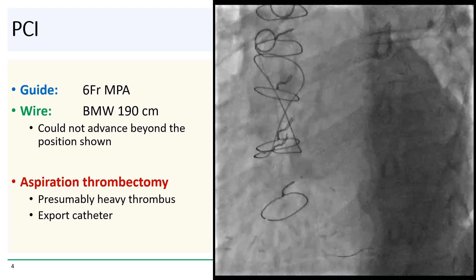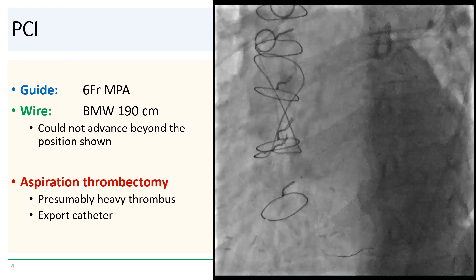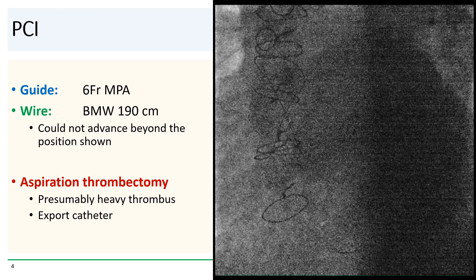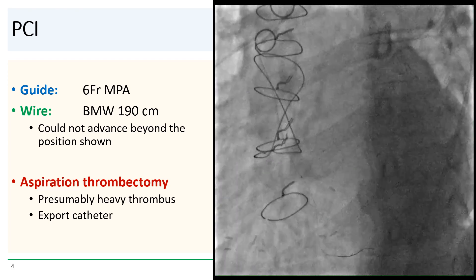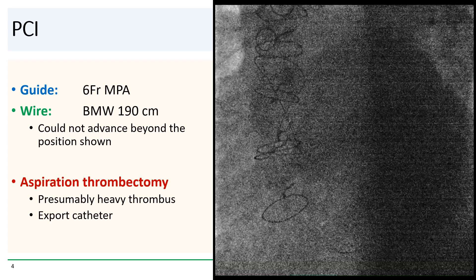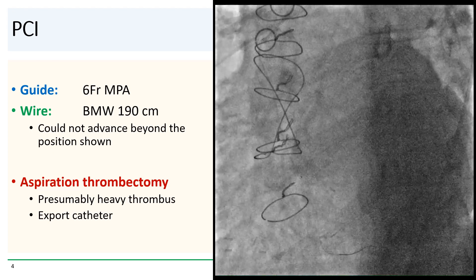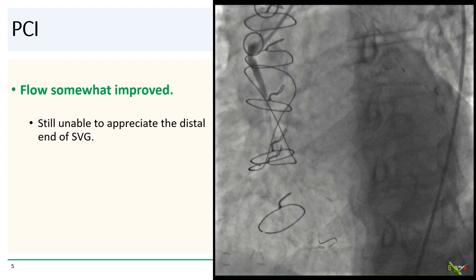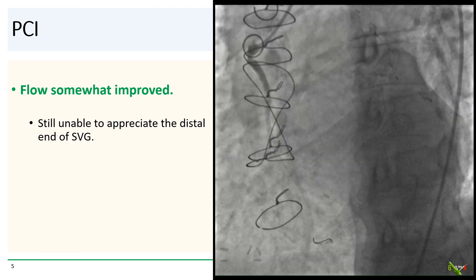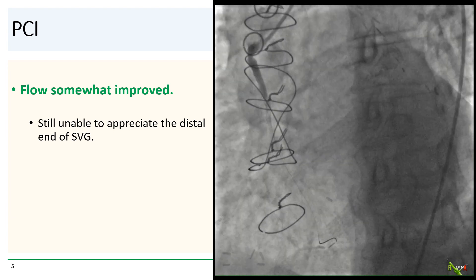So we decided to go after the SVG. We engaged with a six French MPA guide and advanced a workhorse wire to position. The BMW wire had some difficulty going beyond this point. We could not see most of the SVG, but presumably there was a lot of thrombus, so we performed aspiration thrombectomy using an export catheter. After a single pass of the export, flow was somewhat improved. Contrast was now a little further along, but we were still not able to see the distal end of the vein graft.